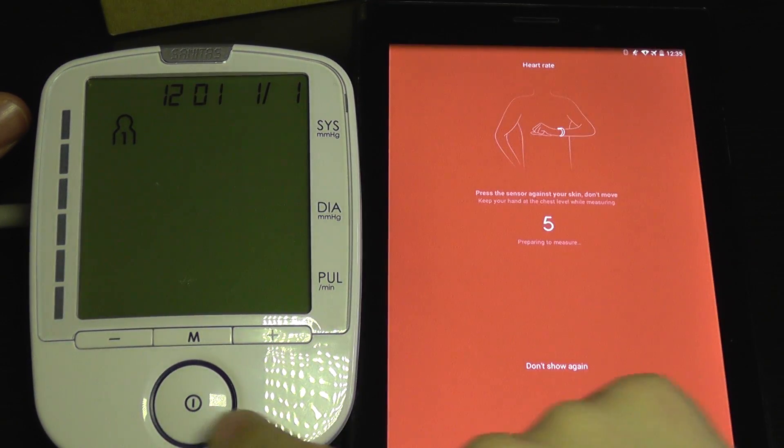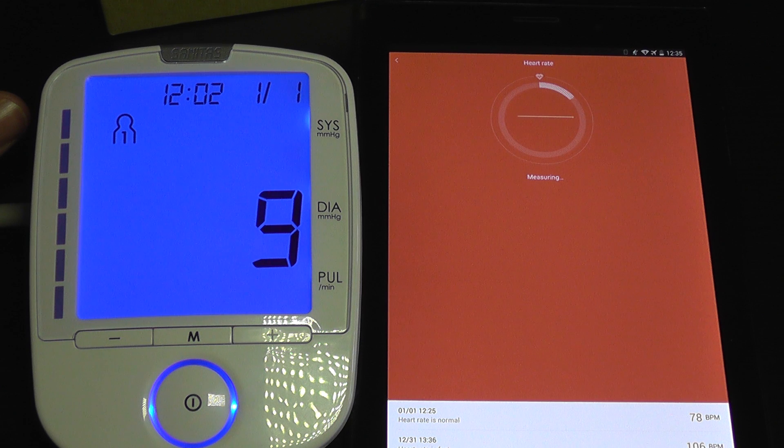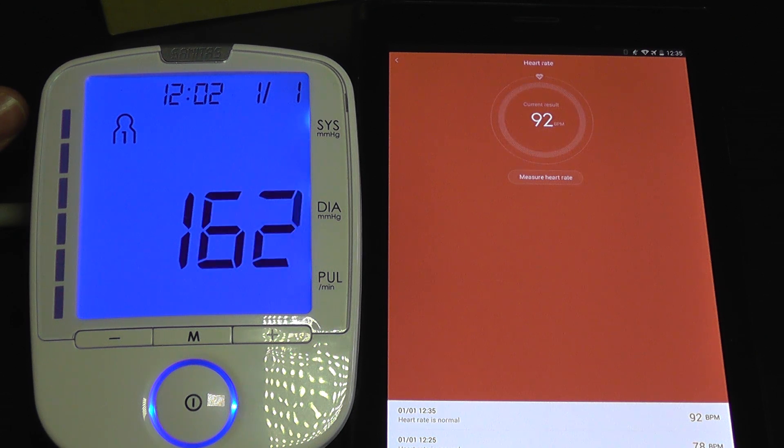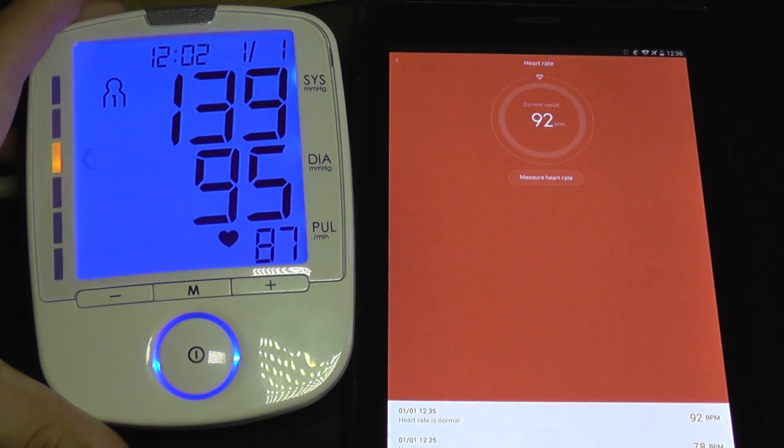I'm going to measure heart rate here and start the test. So I got a pulse of 87 here and 92 here. So it's kind of accurate.